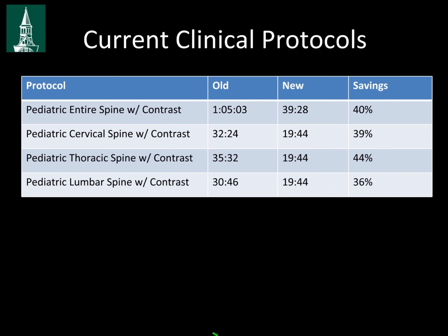These are our actual protocol numbers. This is literally what we started with and what we do now as far as how long it takes us to image these patients. And as you can see, it hovers around a 40% time savings by doing these 3D acquisitions.